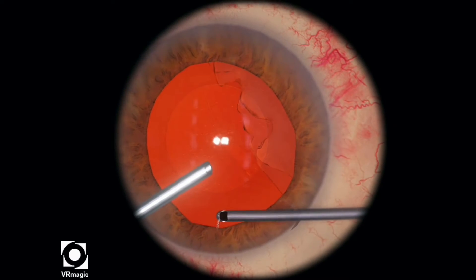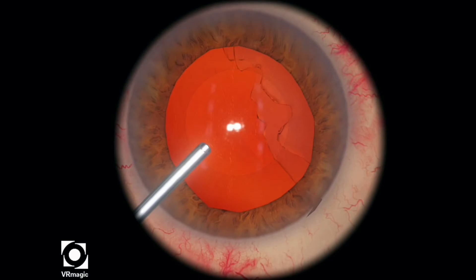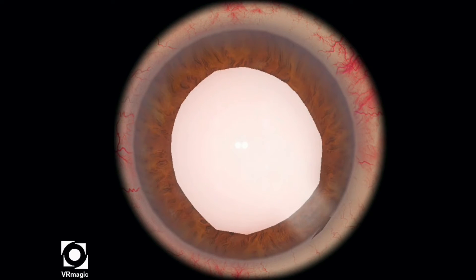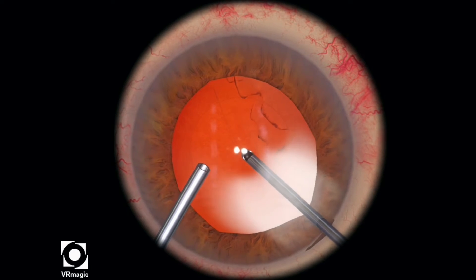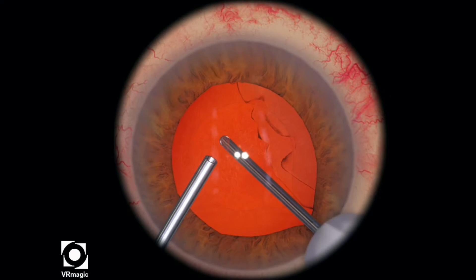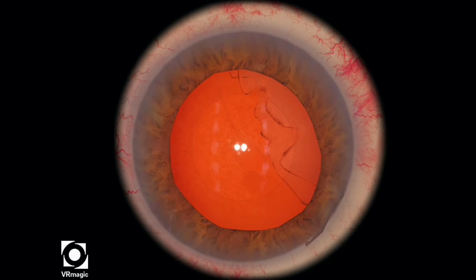Here I'm just chasing after a little bit of the remaining vitreous that's in the anterior chamber, and that looks pretty clean. However, you don't want to stop there and start going after the cortex. You want to restain with the triamcinolone, and you can even push your cannula to the bottom and try to stain a bit of the posterior vitreous as well. Now I'm cleaning up and aspirating the triamcinolone just to see if there's any vitreous left, and you can tell that there isn't. Be very careful when you're near the posterior vitreous and the posterior capsule, because you may accidentally chew up a bit of the capsule.